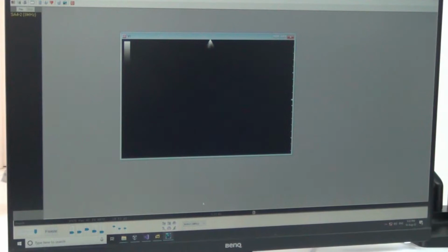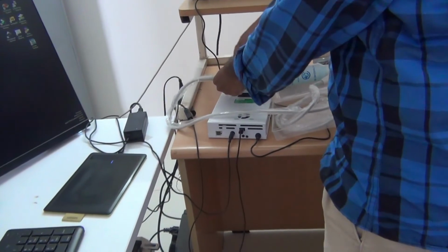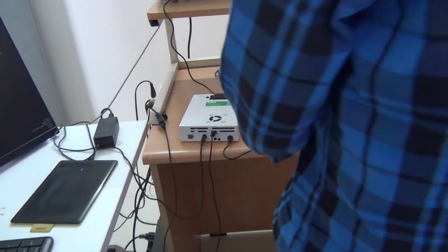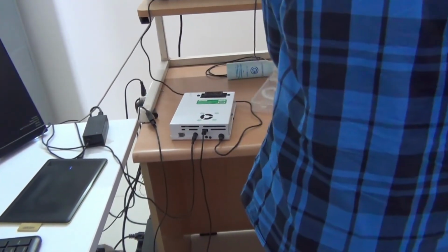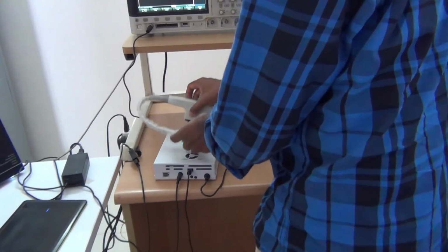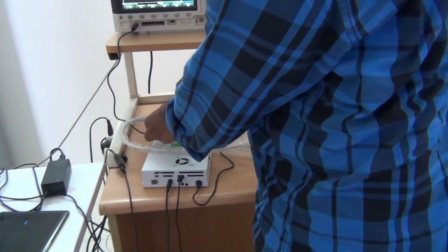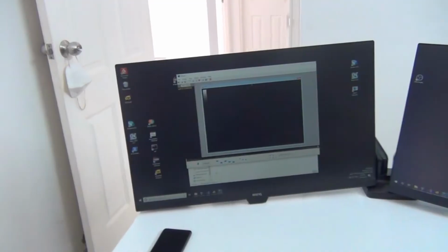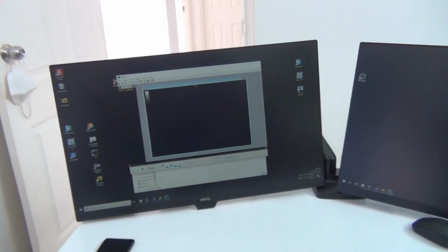Now I want to change to the next probe. What I do is go to this combo box and select the 10 megahertz probe. The software needs to close. We'll say yes, and I'll switch it off. Remove this probe. And I'll connect the linear probe. 10 megahertz probe. I connected it. Switch it on. So this is showing 10 megahertz probe.